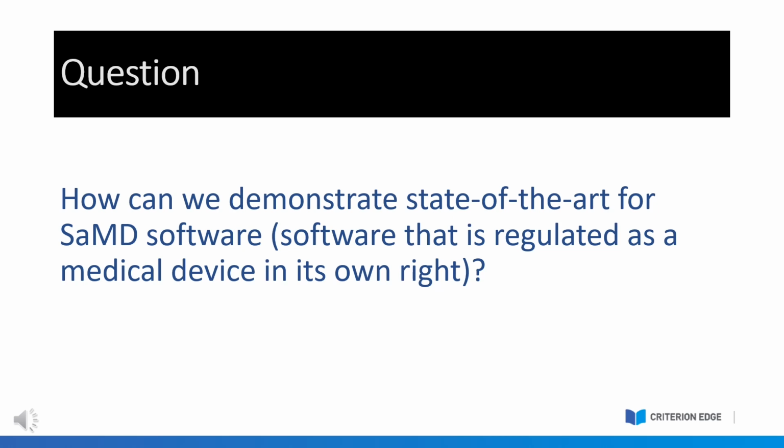Software in a medical device is software that functions interactively with the medical device and probably can't stand alone and probably can't perform these functions in conjunction with another device. It's possible that an SIMD could be used for more than one device, but it wouldn't be like an off-the-shelf software that can be used for multiple purposes.